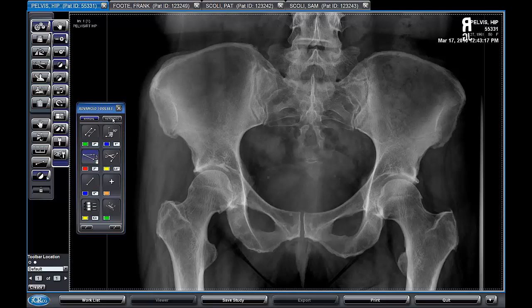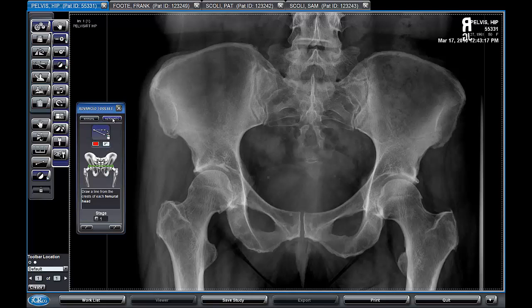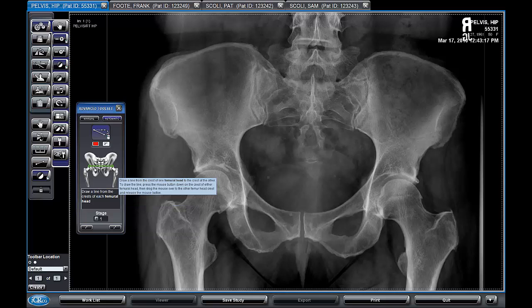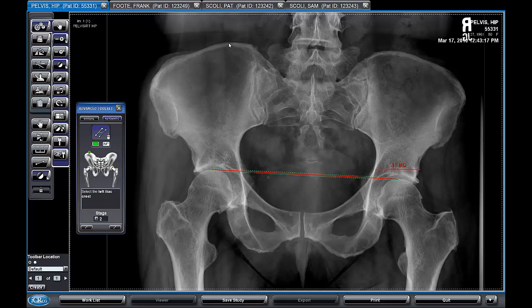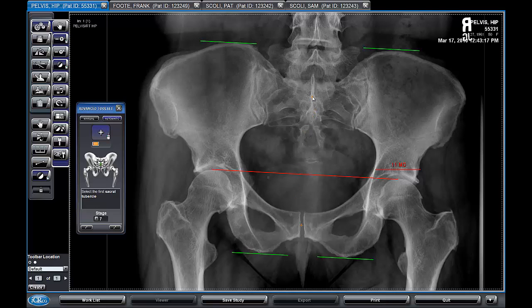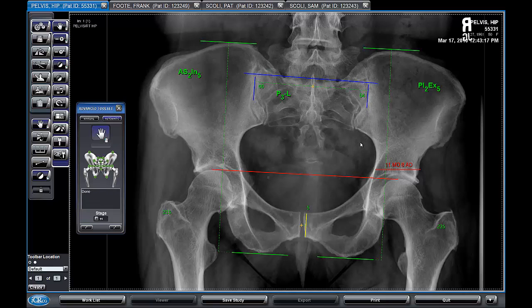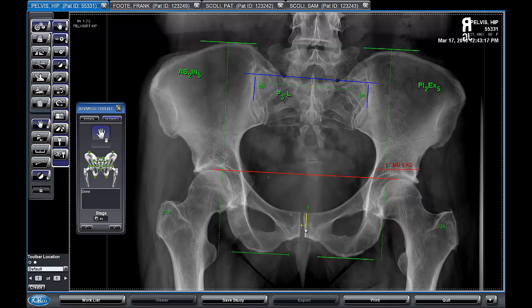The advanced tool set has an automatic button that allows you to do a full pelvic markup in about 20 seconds. It changes the tools automatically for you and tells you what to do on each step. We can see that it places several measurements automatically. These measurements are dynamic, so as we change what's being measured, we can see how it's reflected in the final measurements.